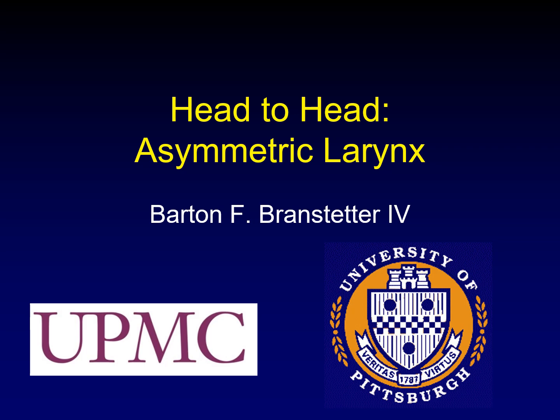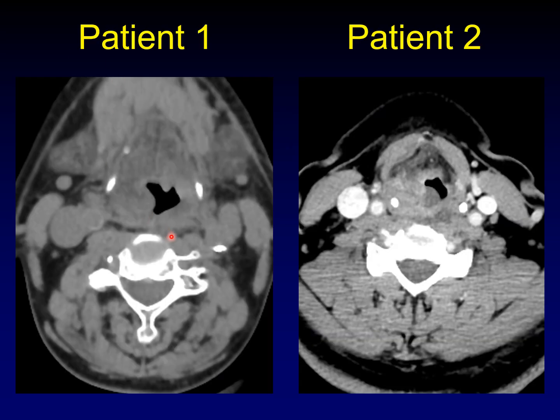In the head-to-head series, I show you two different patients with two different diseases that have a similar radiologic appearance. Here are the two patients. You can see there is something asymmetric about the supraglottis, where one side is thicker than the other side. This would be a good time to pause the video, look at these images, and decide what you think is going on in each of these two cases.